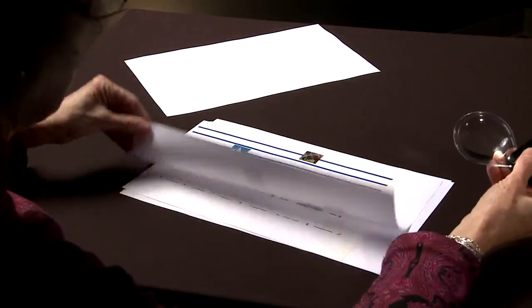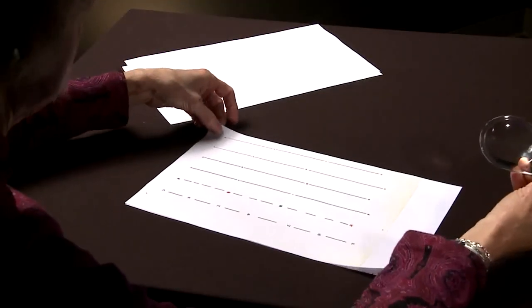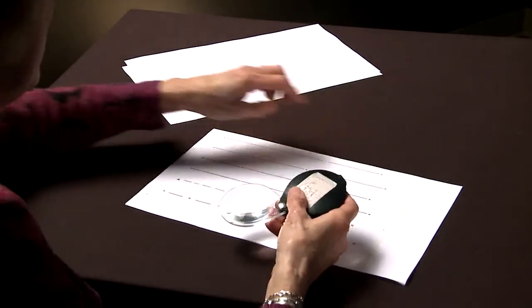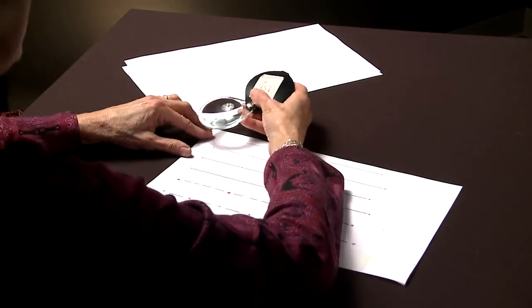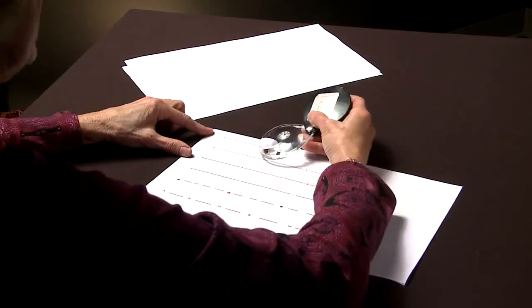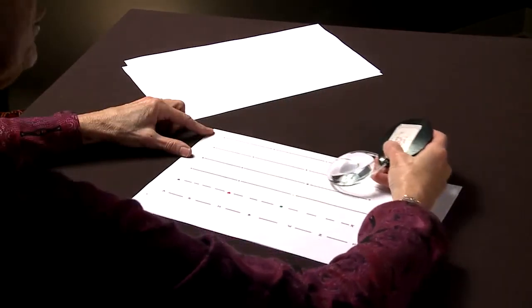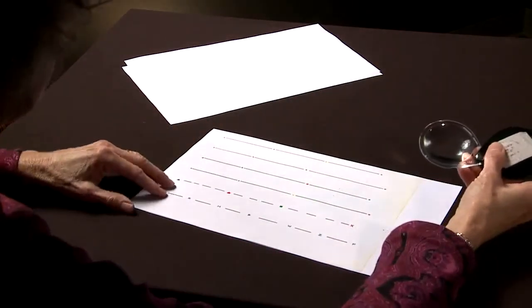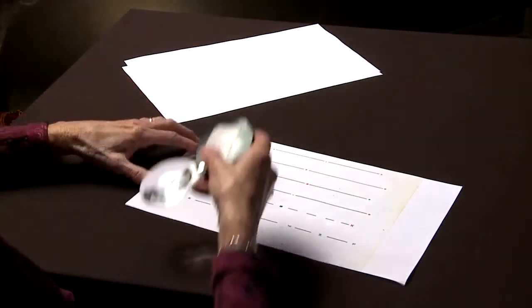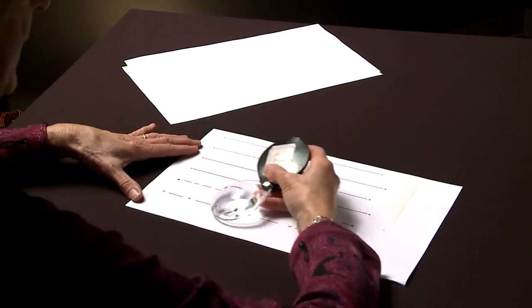From those big bold lines, we're going to progress to smaller lines, and these lines are narrow, and there's little bitty colored dots here, and I may say scan from left to right and tell me what colored dots you see as you keep going. This is a little bit easier because the lines are spaced pretty far, and then what you see happening here are dashed lines, so they have to maintain that left to right even scanning.